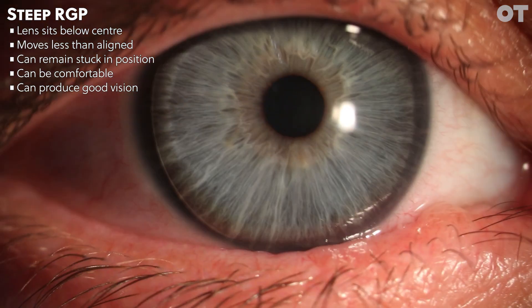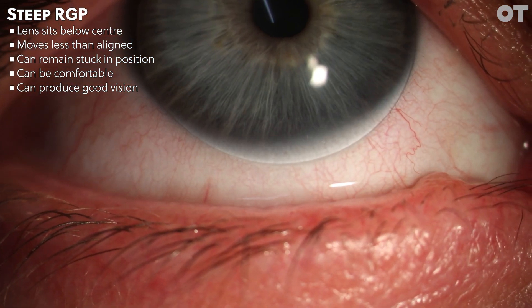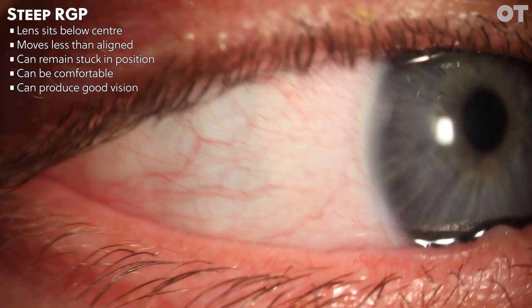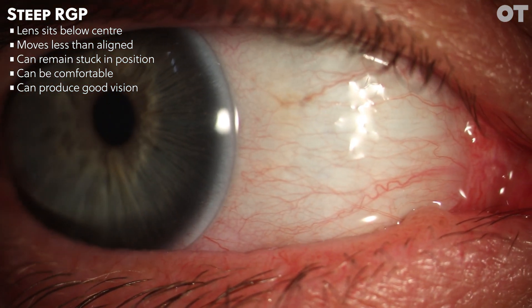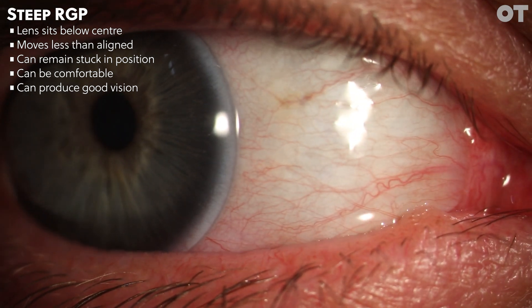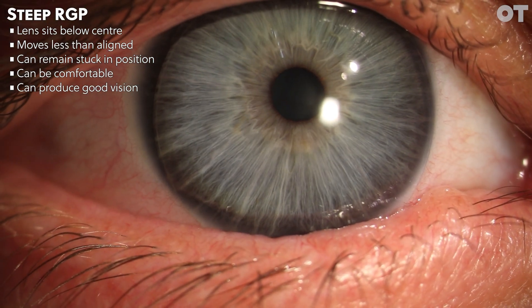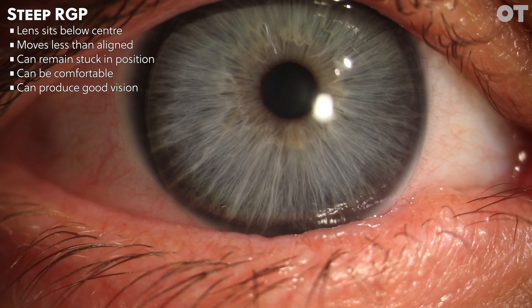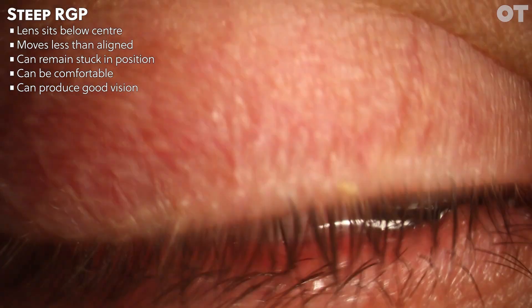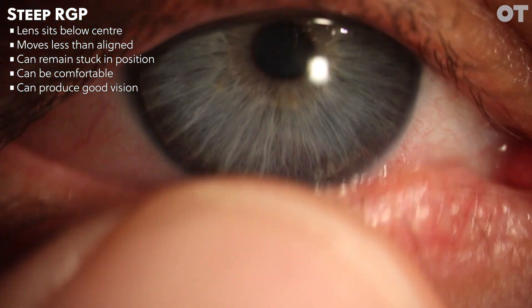Here we can see a steeply fitted contact lens. In this video, we can see the lens is sitting slightly below centre. The lens is moving, however the movement is much less than the alignment fitting of the previous video. If the lens were particularly steep, a large post-lens tear layer can create surface tension, which can fix the lens in position so it hardly moves at all. A steeply fitted contact lens can be relatively comfortable for the patient, particularly because of the reduced movement and reduced lid interaction of the edge of the contact lens.